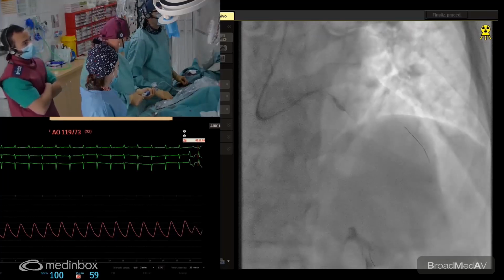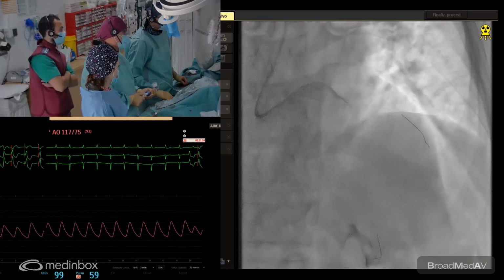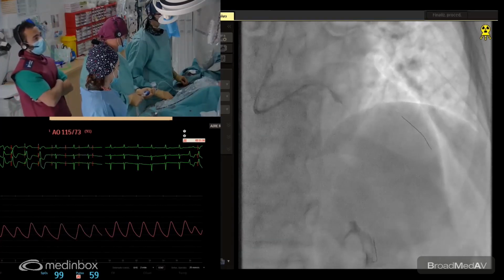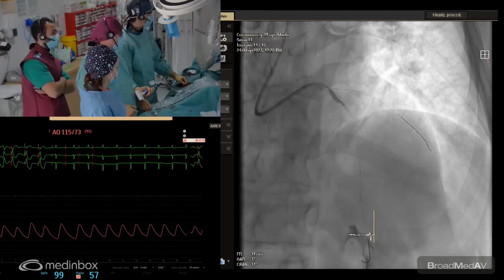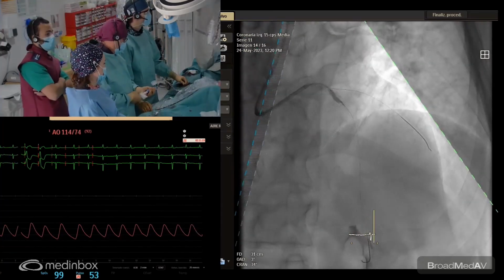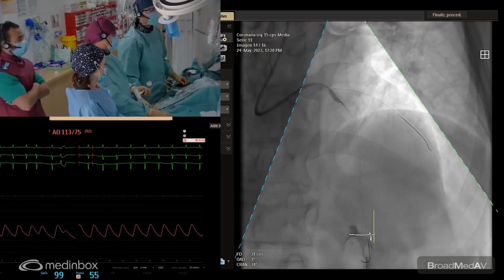4. There is no consensus about that, to the best of my knowledge, but the recommendation is to administer at least 20 pulses in each lesion. You can see there the extra beats, the capture, 6. I think the expansion is not bad. Down.